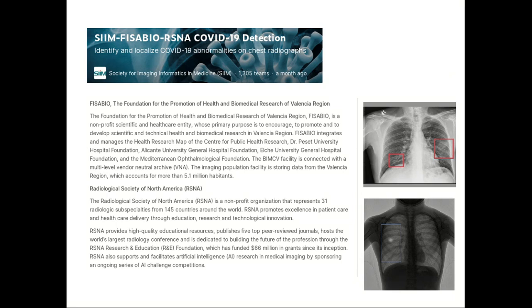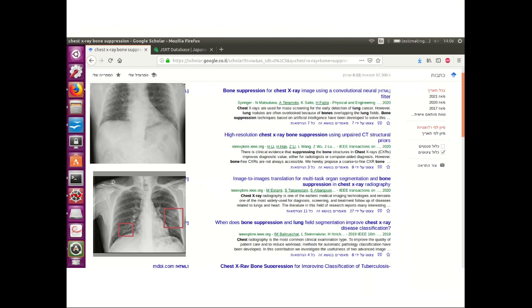But instead of diving directly into the chosen model architecture and the training algorithm, it would be wise in this case to put some effort into pre-processing. A quick literature reading on the subject of chest X-ray imagery teaches us that the bones, the ribs in the chest X-ray, may significantly decrease the accuracy of detection and localization of the object of interest. So removing the bones from the X-ray image, if possible, is highly recommended as a pre-processing stage.